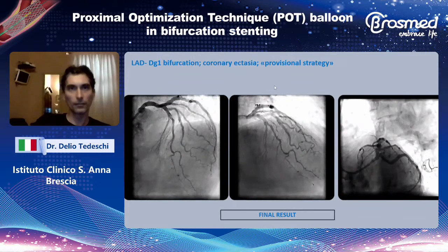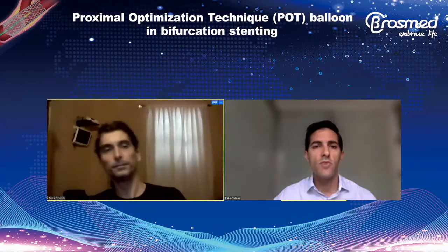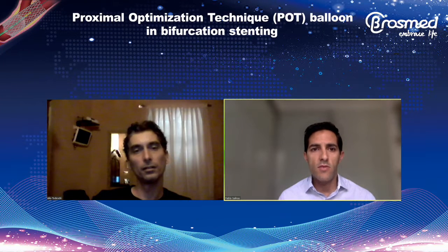Thank you very much, Delio. I think it was a quite simple solution for a very complex case, and you very beautifully showed us how intracoronary imaging is very important and how you can go step by step and solve a very difficult situation with really one stent and one drug-coated balloon in the end. That's a great result. Thank you.